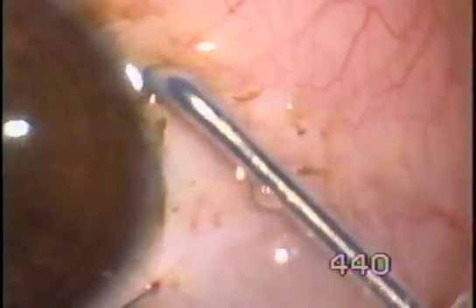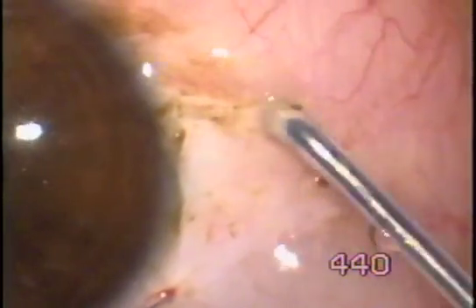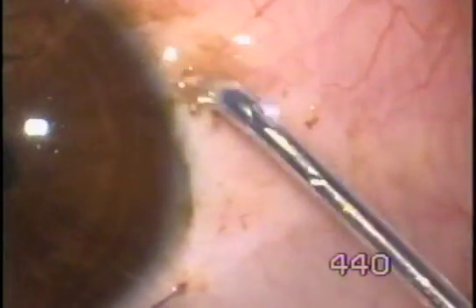Keep the conjunctiva wet. It's a very simple procedure. There is no need for forceps, scissors, or sutures like treatment.